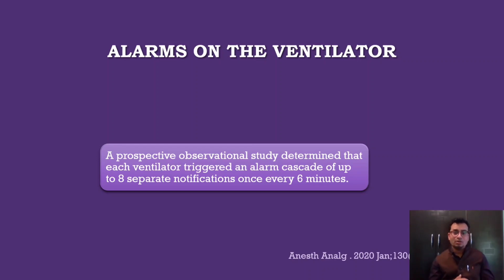Not all alarms generated by the mechanical ventilator provide actionable information, and that is the reason they must be set to appropriate settings, taking into consideration the patient's clinical conditions, which is often ignored while setting the alarm settings. So that's very important.